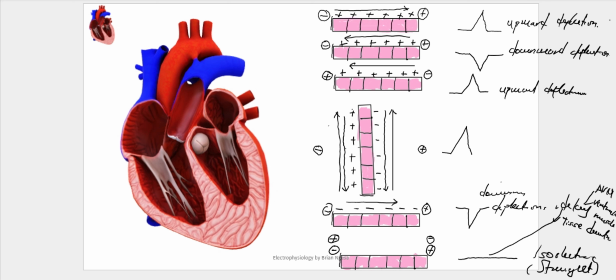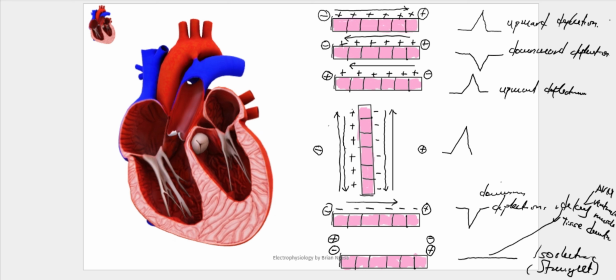So positive charges moving to the center, and away from the center, it will seem as though it is moving a distance away from the positive charge, in that you can extrapolate this all the way down. So you'll say that it is moving away from the positive.